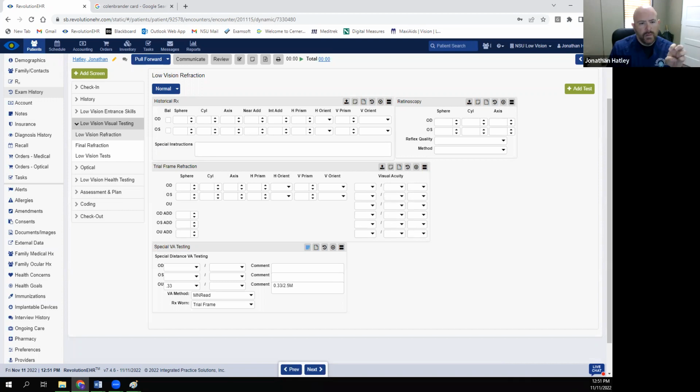This by far is one of the more difficult tests to conduct, and therefore is the most technical for the students. And so in this case, you need to be judging if you felt like they did it in a competent manner, if they were professional, if they were able to get the test completed within the 10-minute allotted time. All those things would feed into their overall competency score. But as always, you are the proctor. You get to make the final decision. If you have any questions or concerns, you can always talk to myself or Dr. Ma.